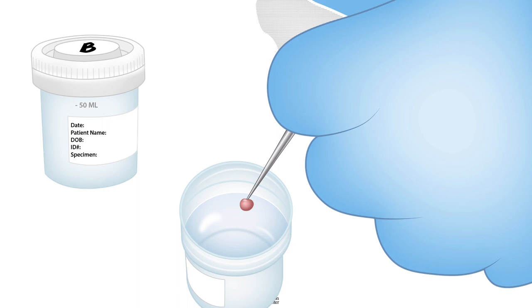So here we have learned about the role of the polyp trap to collect polyp tissue, and the single most important thing to keep in mind is to set up the polyp trap before you give the snare to the endoscopist. By following that simple precaution, you would avoid the mistake of polyps getting suctioned into the suction container. And if that happens, all you have to do is at the end of the procedure, open the suction container and then make sure you have the polyp trap and suction all the contents from the suction container, and that's how you can retrieve the polyp tissue.